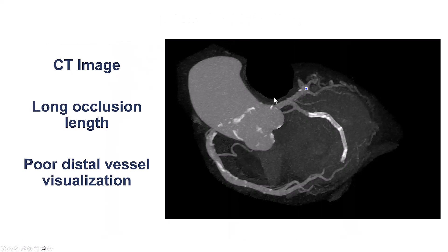The coronary CT angiogram can be very useful, especially in cases of poor visualization distally. Here we see something in the obtuse marginal territory, but the visualization remains fairly poor. We do see that there is a long stent length and long occlusion length.